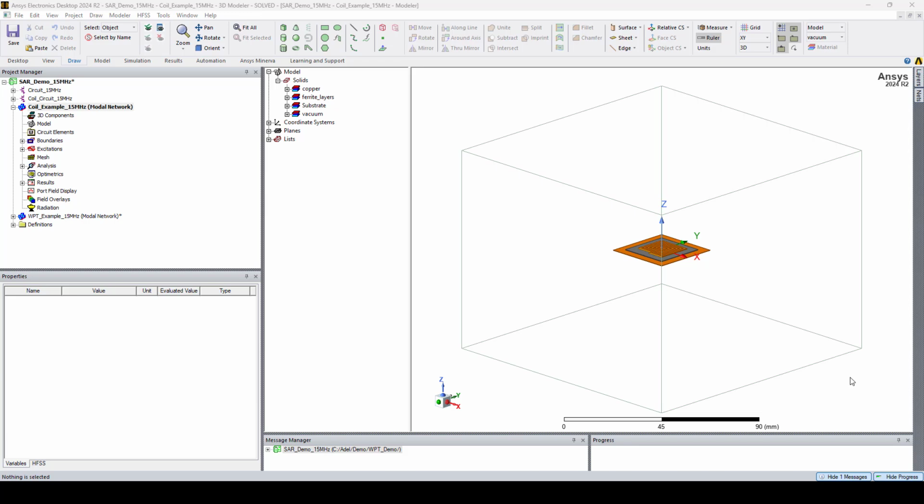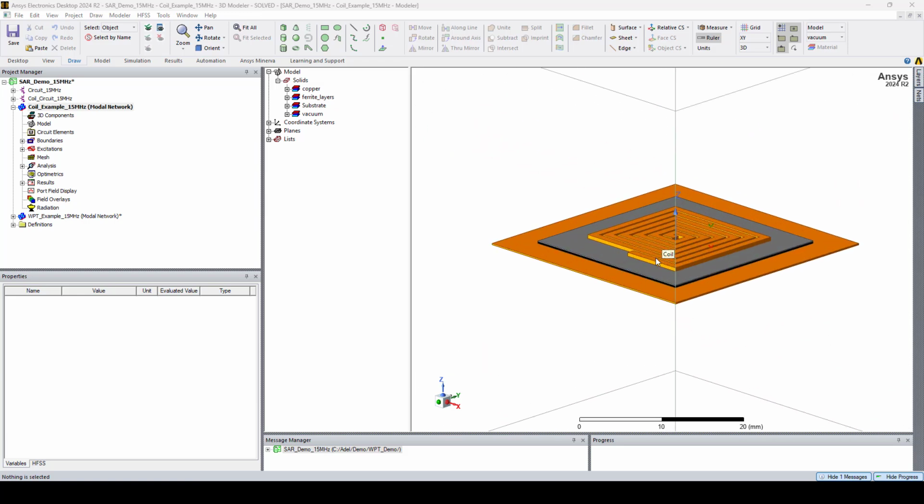Simulating the transmitter or receiver coil by itself in HFSS helps determine its inductance, which is used to calculate the necessary capacitance to achieve resonance at the desired operating frequency. This is the transmitter by itself. It consists of this copper coil, a substrate, a ferrite layer, and a copper layer.